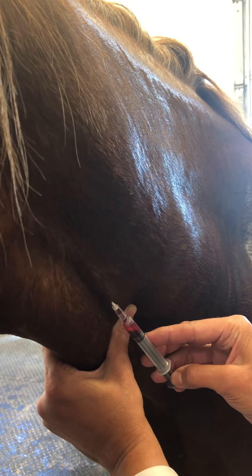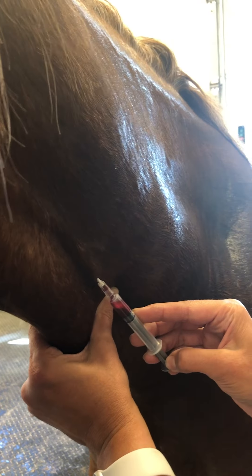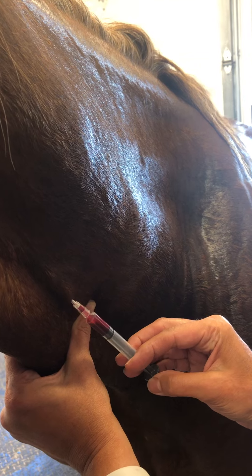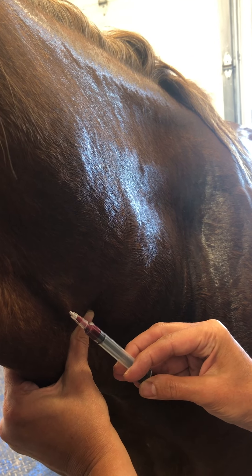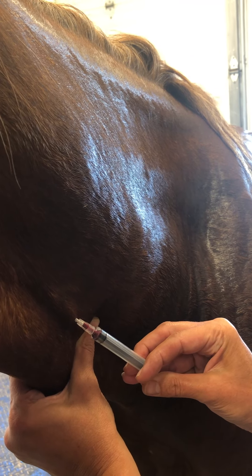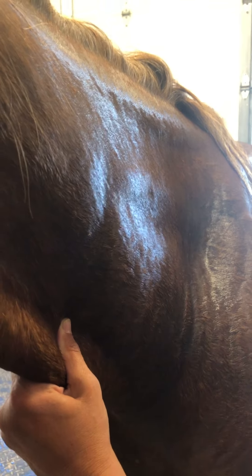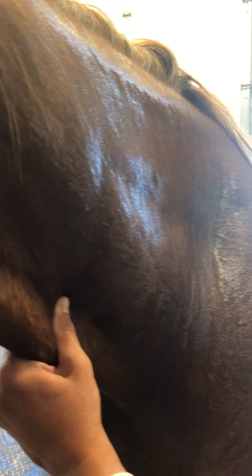Now pull back again — see how your syringe is filling with blood? So you gotta be in. Push it — the whole thing. Perfect. Hold your thumb there for a sec.